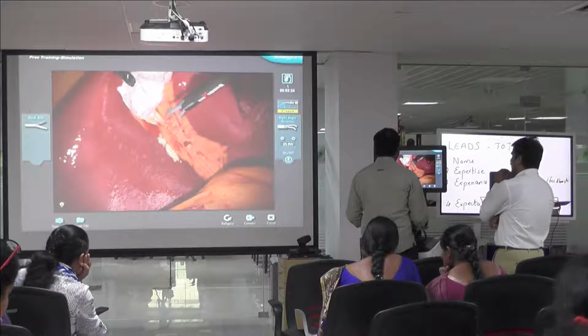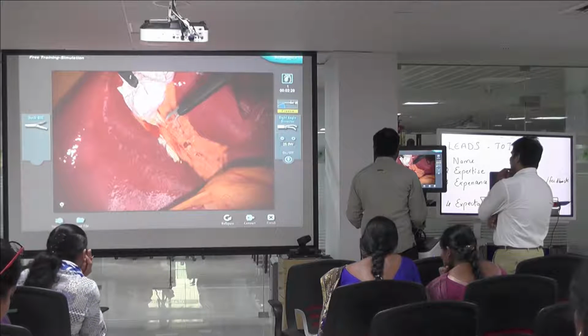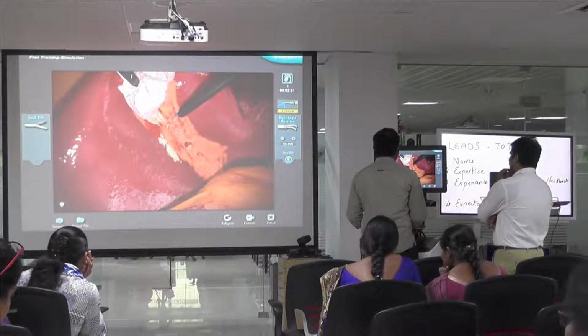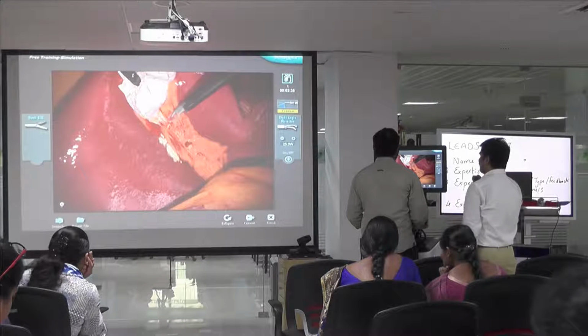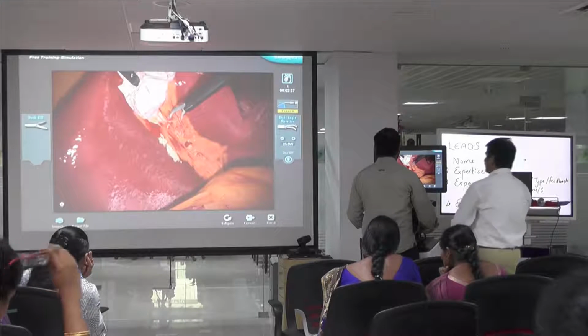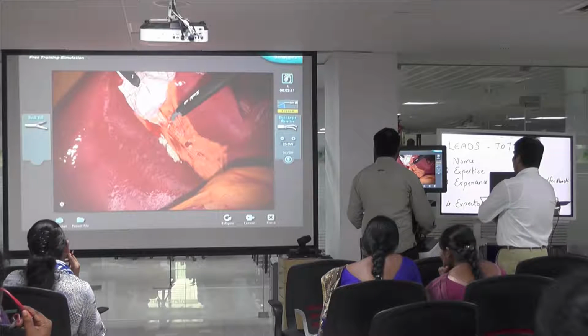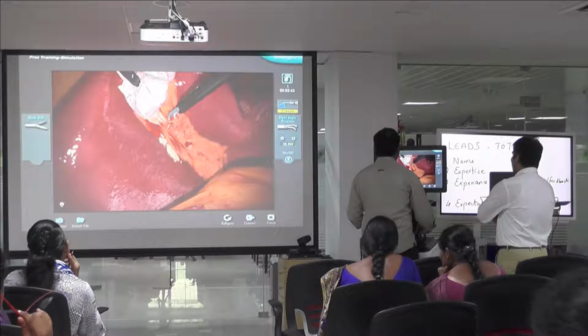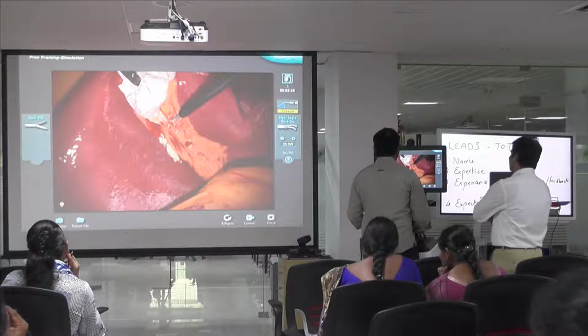Yes. Go. Change the direction of the right hand. Yes. Just try to hold in the teeth, not to hold into the body of it. Change the direction. Yes, so that you can see the palm. Correct.